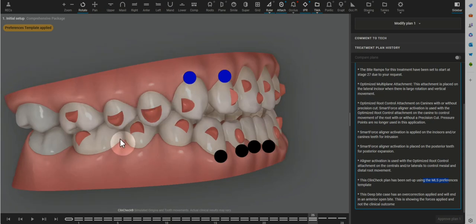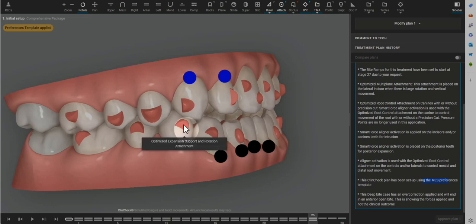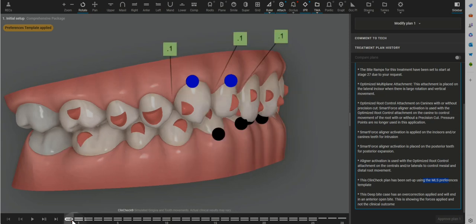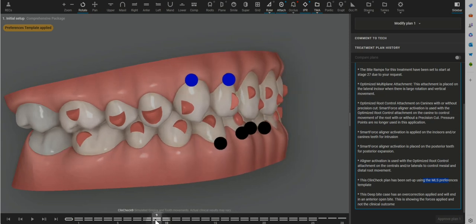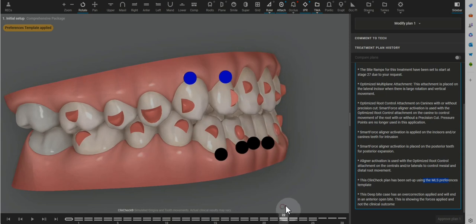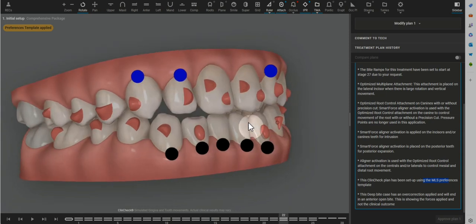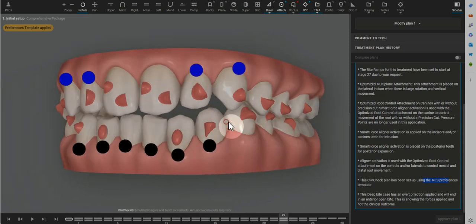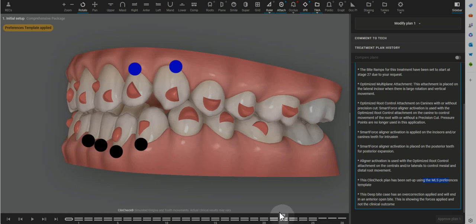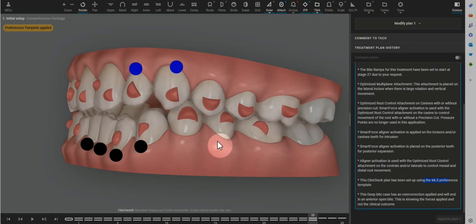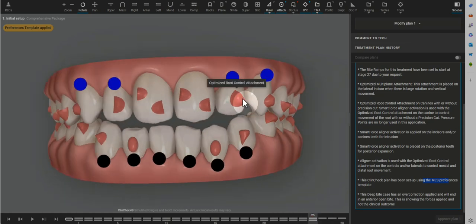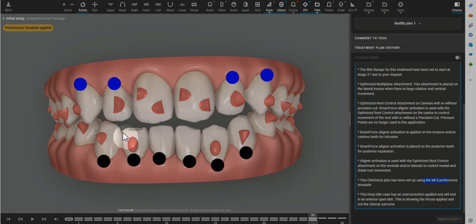Changes that I would make to the MLS template would be to not rotate this premolar and prioritize a retention attachment. I also wouldn't do any rotation of the molars as it's really not critical to the final occlusion for this adult patient nor the overall goal of the case. Other change that I would make would be to the laterals.